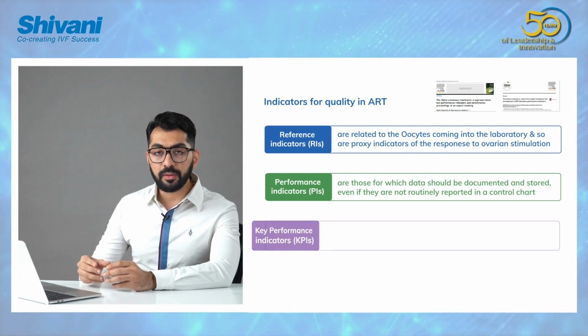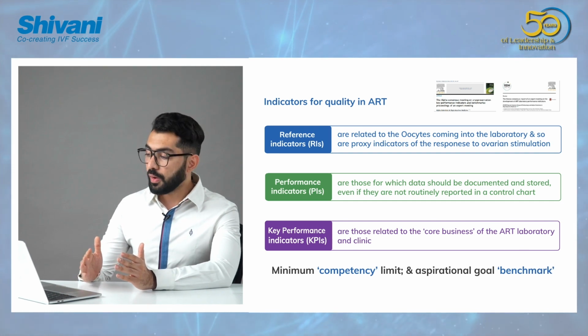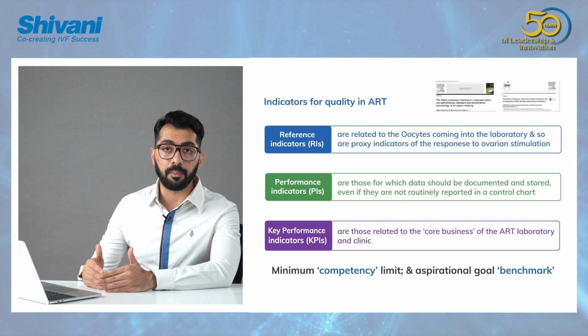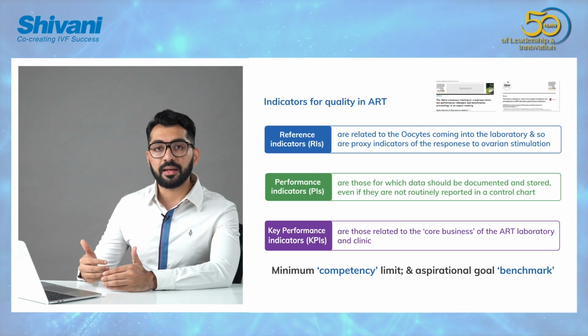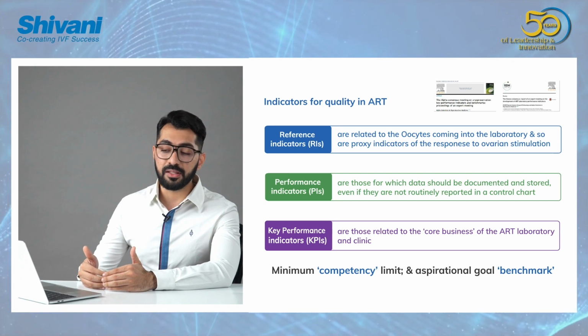And when we talk about key performance indicators, now this is the core business of an ART laboratory. Now without these key performance indicators, which are 12 in number, any laboratory would not be able to monitor the quality of its performance. And that's something that each and every lab director should actually ensure that their lab is following.